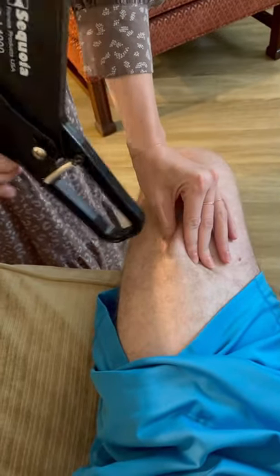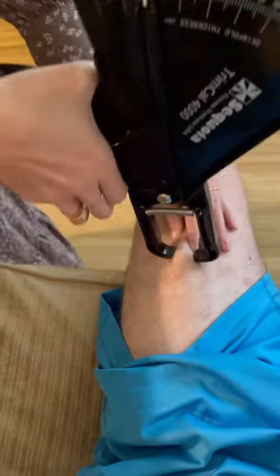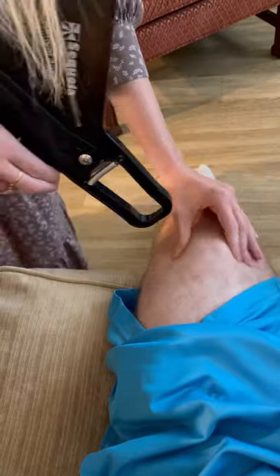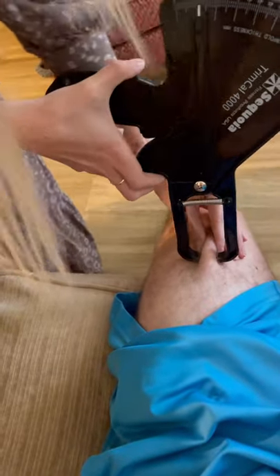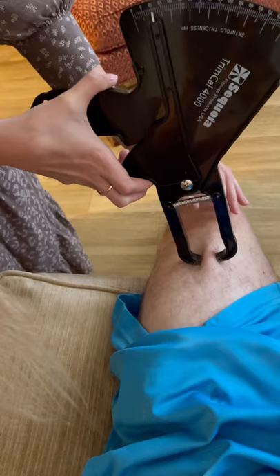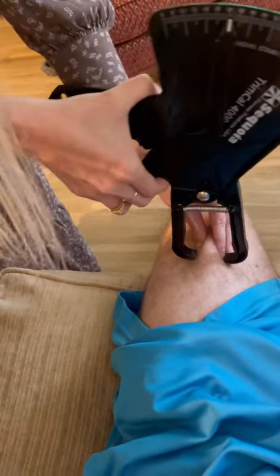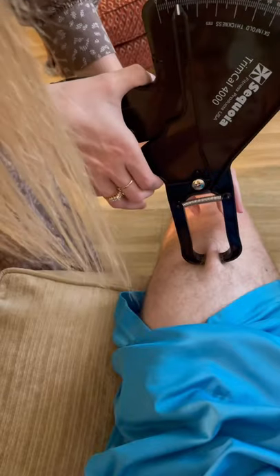Now we're doing the thigh skinfold. Make sure your leg is completely relaxed. Move your leg out a little bit so I can get there. Readings are 10 and 10.